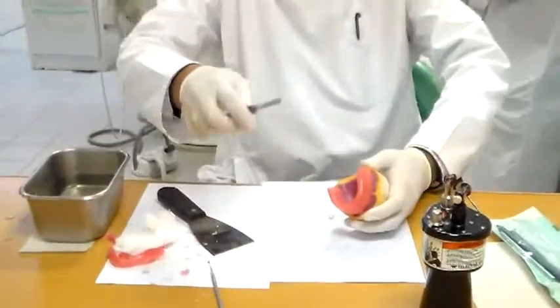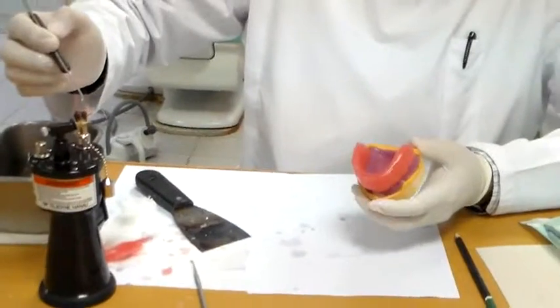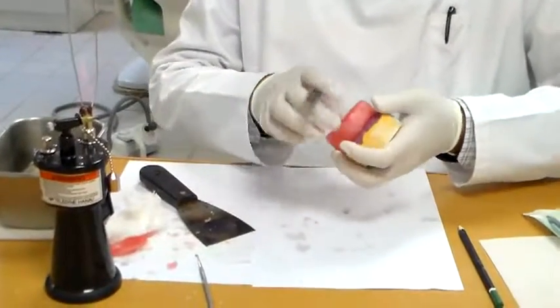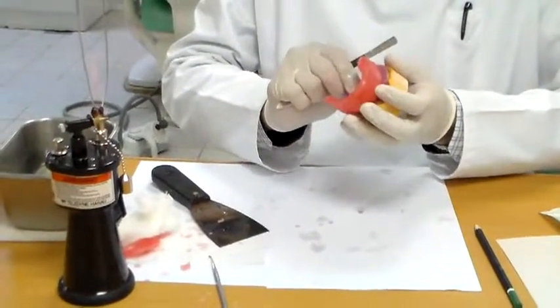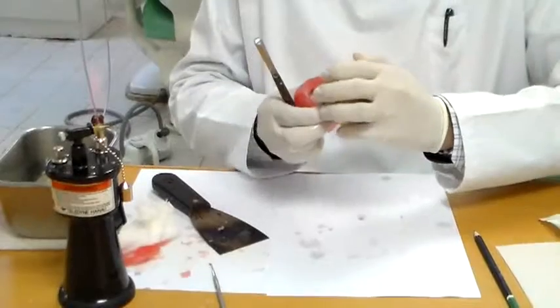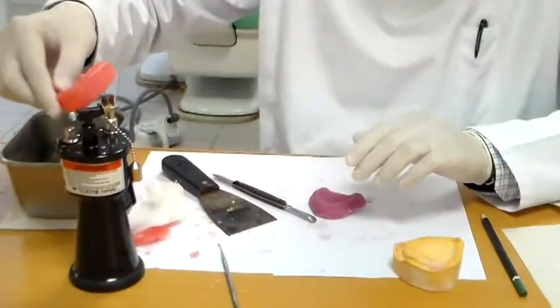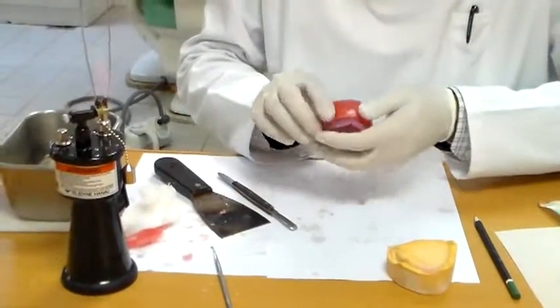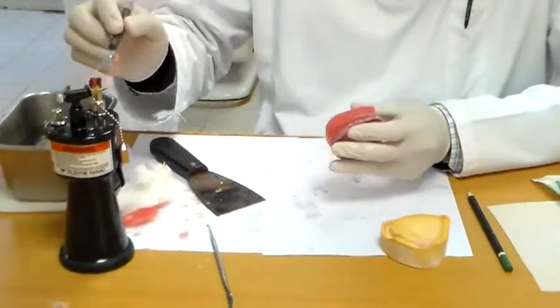You want to use the back end of your wax knife. Seal up the, take it off my cast. Adapt it onto the cast. Back end instrument.